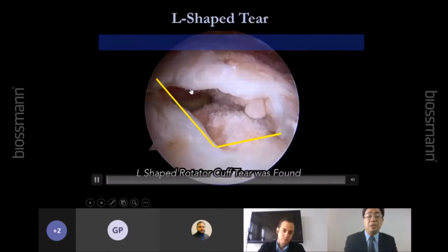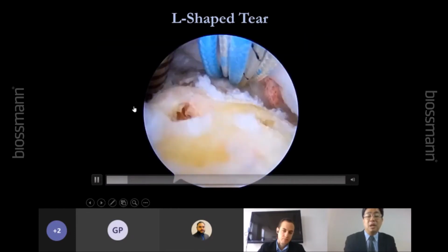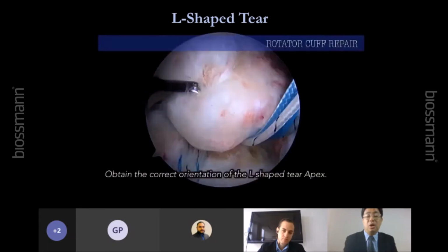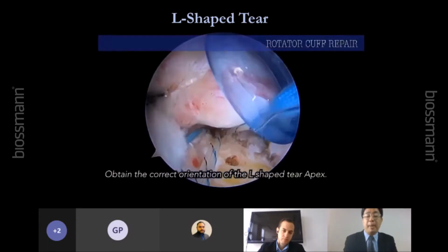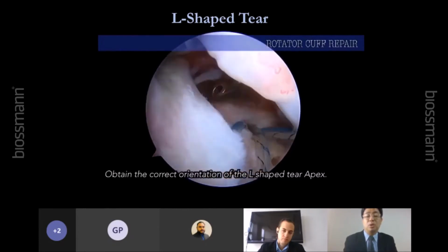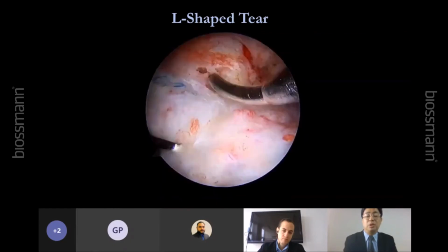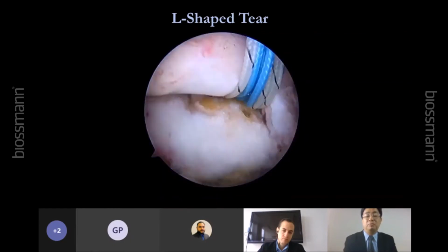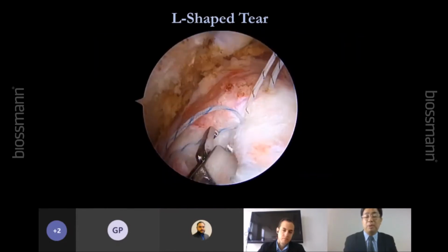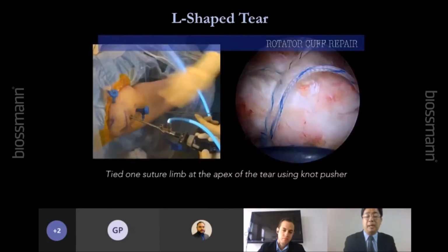Okay, like in these patients. So I pass one in the front. This is the anterior comma tissue. Okay, I always anchor, and then I reduce the apex first. Okay, using the suture hook, and then pass the suture into the rotator cuff. So I think the distance between each hole is quite important. You should not put it too close. Okay, and then reduce the apex.